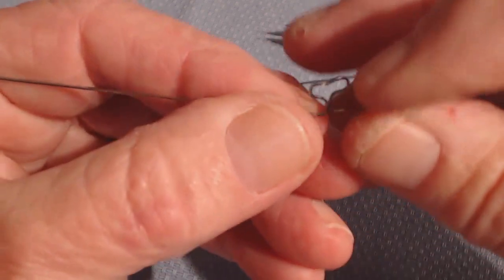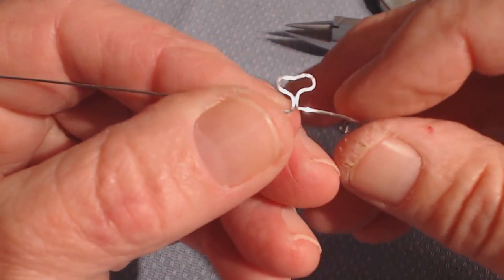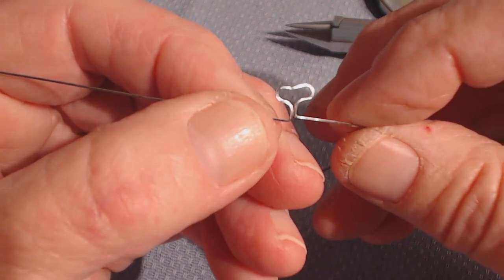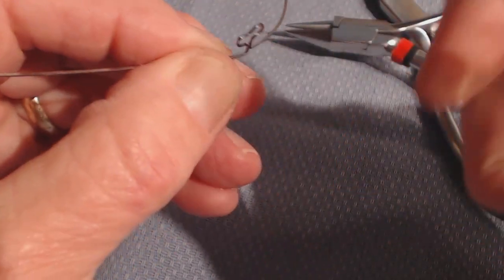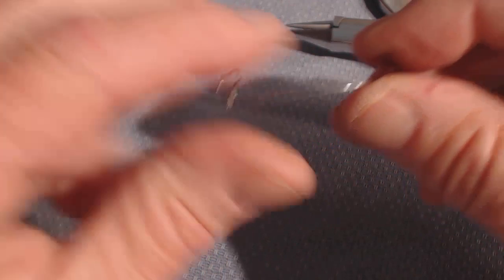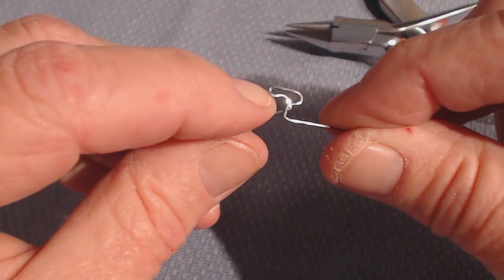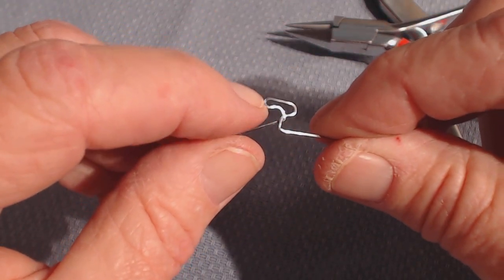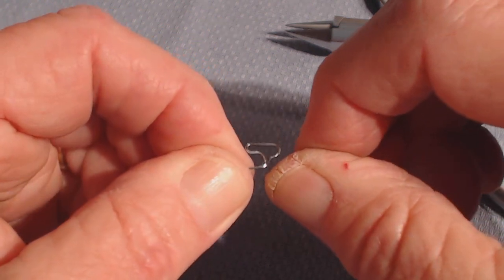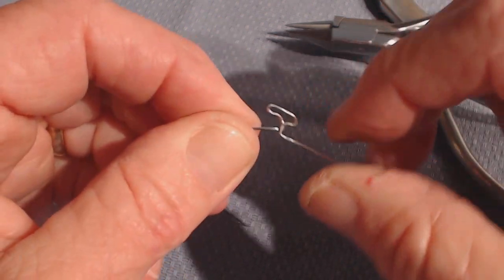Remember, on the first squeeze, don't squeeze fully together or the intrusion bend is going to be way too big. Just a little bit. And don't use the bend on the mesial side of the loop unless you're very experienced. It's just too dangerous to do it that way.